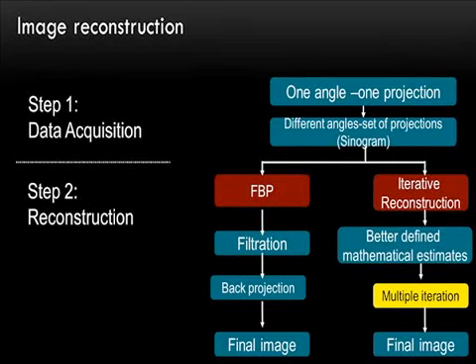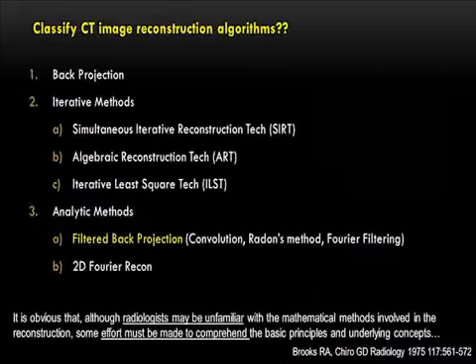So starting from the sinogram, either we can take the route of filtered back projection, which we have been doing for the past 40 years, or we can take up this newer iterative reconstruction algorithm. For simplicity, I'm going to call them IR, which have better defined mathematical estimates, and you have multiple loops of iteration to get your final image.